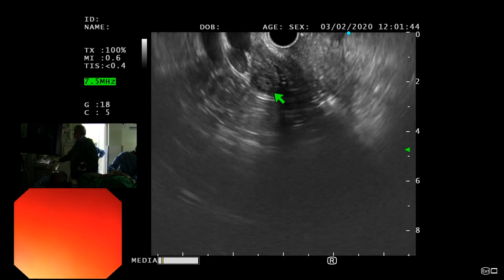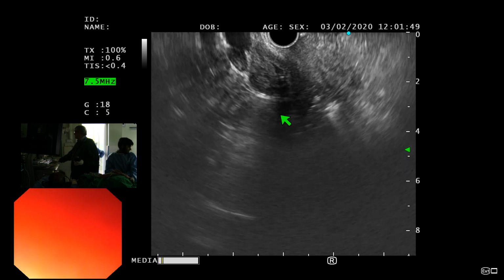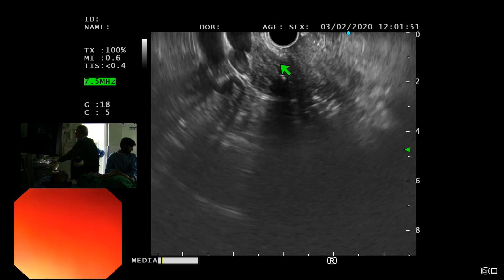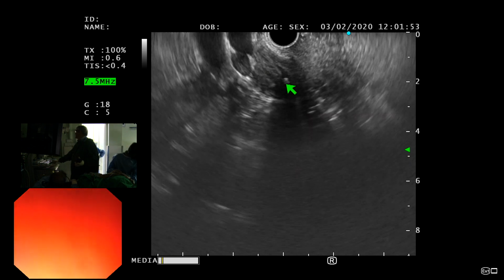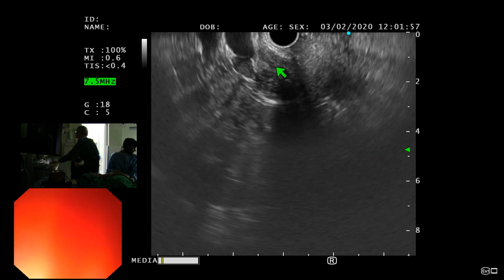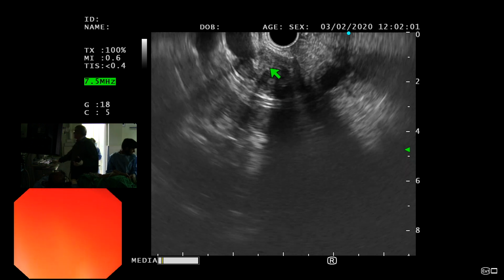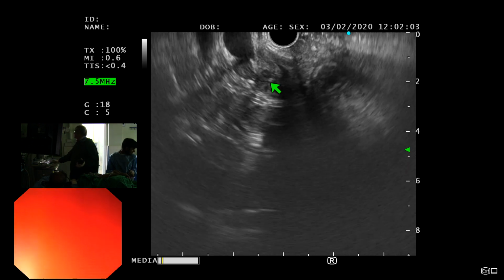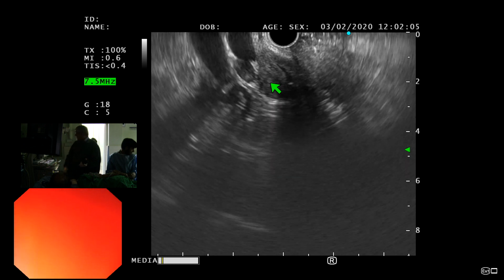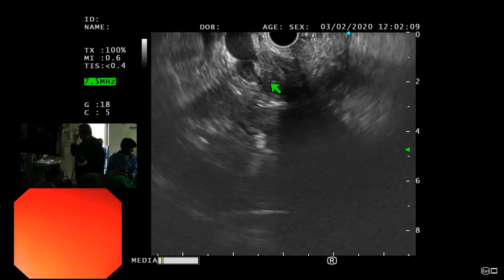What do you think, Khalid? I think that's not a bad idea because that's where the stricture is. Is this a safe area to do it because the stent is already in there? There's no risk of bile leak there. So I think it's a good idea to go after that FNA at least once. And you may hit the stent, which is okay. You can move it around.